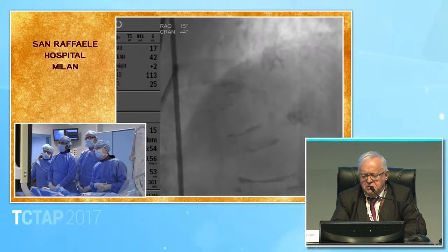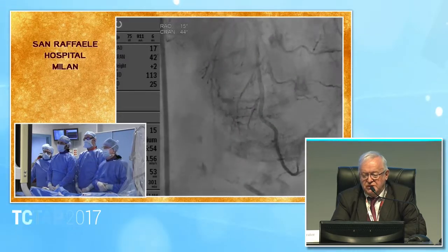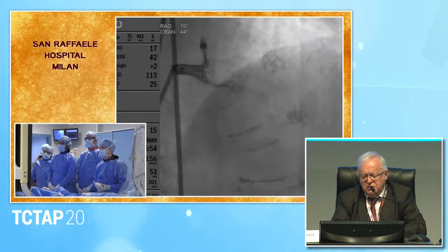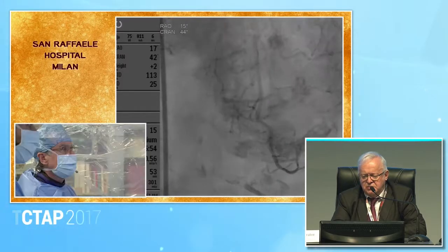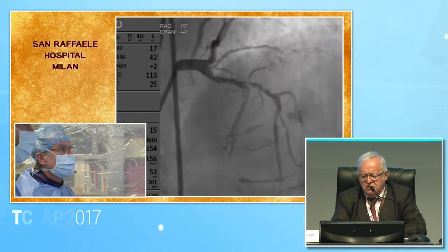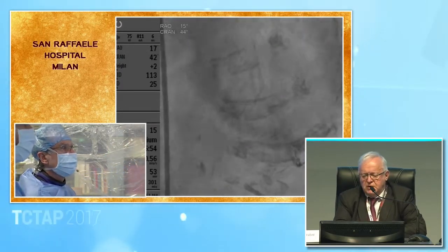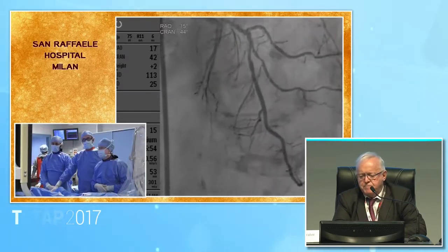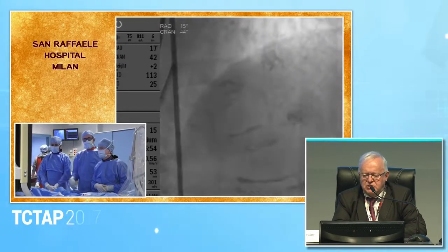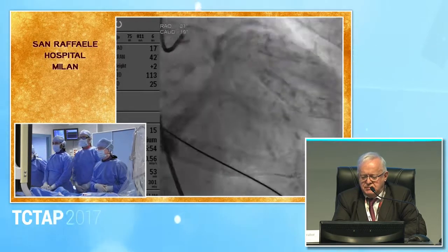If you go from proximal LAD to distal, the second to the third diagonal will be 48, maybe more, so it's a very long stent. So personally, I will do from proximal LAD and stop before the second diagonal. Maybe we can see another projection, to be sure. So you will leave this lesion distally. Let's see the RAO. Let's see the right oblique. We did that caudal.